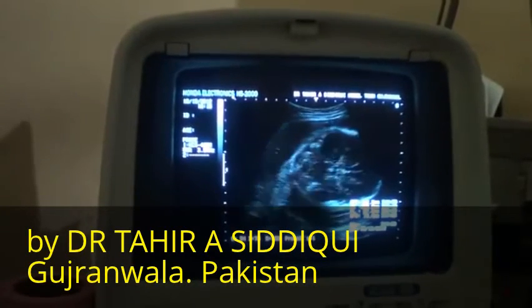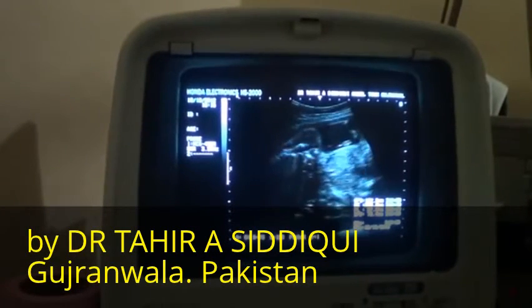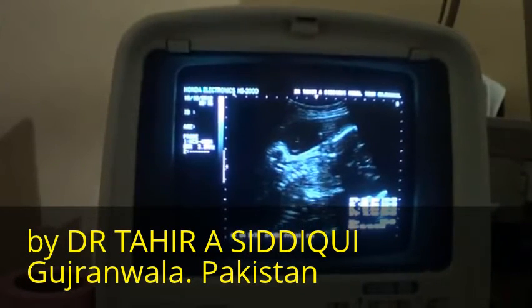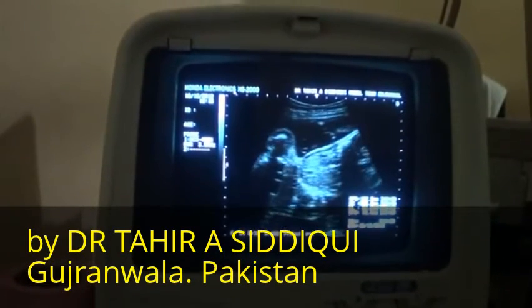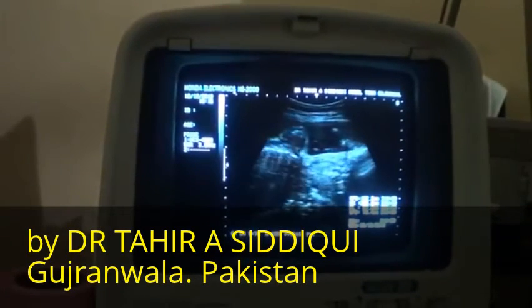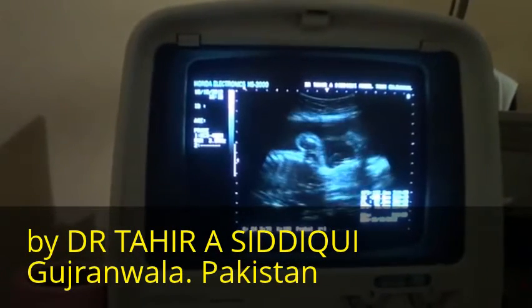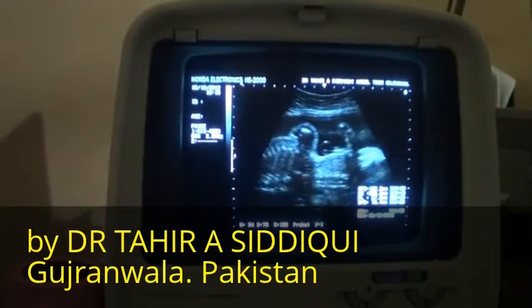Head of the fetus. Here we come towards the spine, the neck region, and in the neck region, between the neck and the cephalic portion of the head, this is a solid mass seen at the neck region.